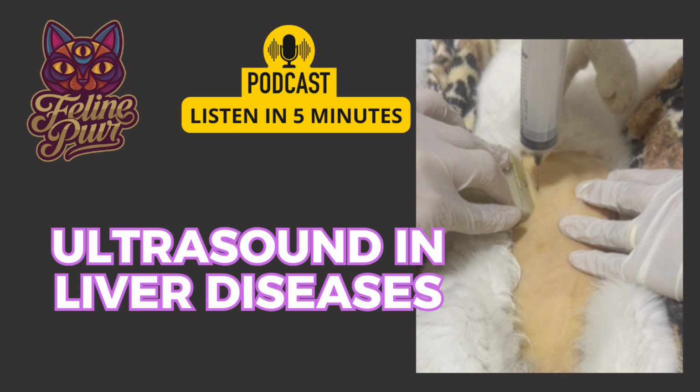Comparison with the spleen can also be helpful, as the spleen is normally hyperechoic relative to the liver. A useful tip is to compare the hepatic parenchyma with the falciform fat, as in normal cats, the liver is typically hypoechoic in relation to this fat.